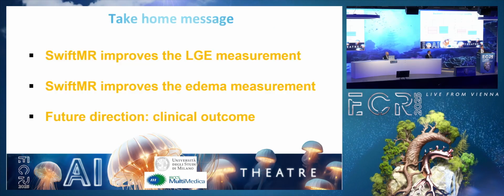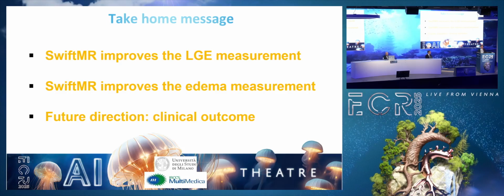But we believe that with this software, with the increase of the image quality, we can improve the quality of late gadolinium enhancement and edema enhancement. But of course, we have no reference standard in this case, because you need autopsy to have the reference standard about the grams of fibrosis or edema.